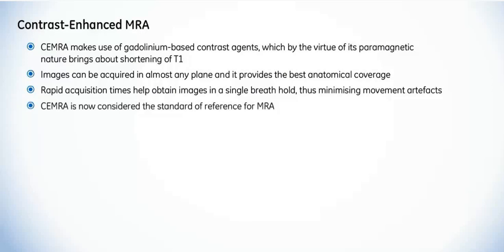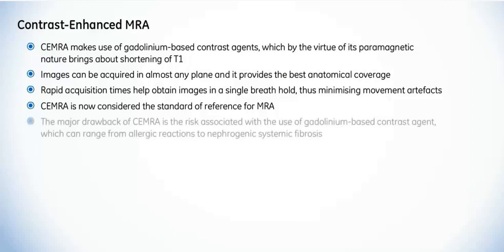CEMRA is now considered the standard of reference for MRA. All new MRA techniques are compared against it. However, the major drawback of CEMRA is the risk associated with the use of gadolinium-based contrast agents, which can range from allergic reactions to nephrogenic systemic fibrosis.